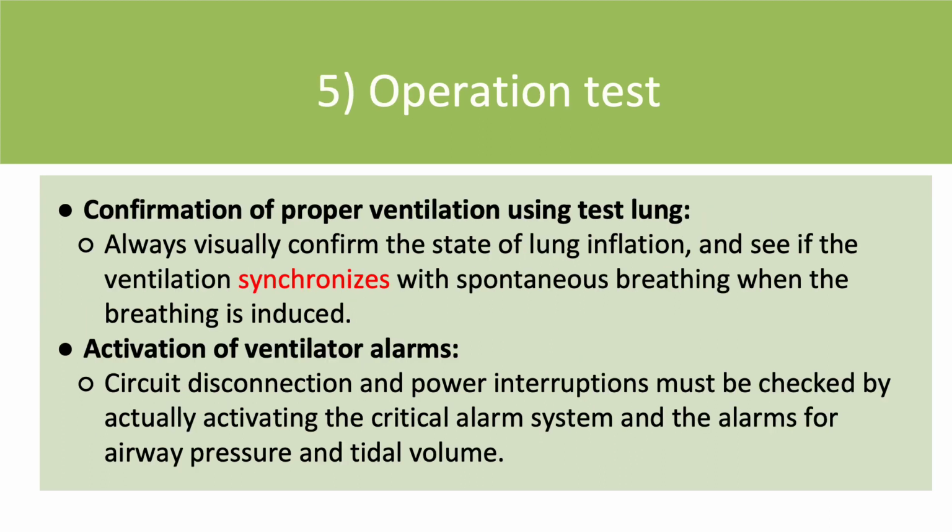The last part is the operation check. Operate the ventilator with a test lung, and visually check whether or not the air goes into the lungs and the ventilation synchronizes with spontaneous breathing. Also, check the operation of the alarms in the same way and see if they work properly. Once the operation check is completed, the ventilator is ready for use.